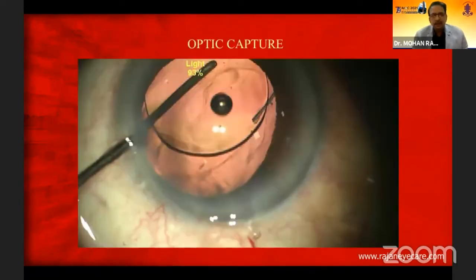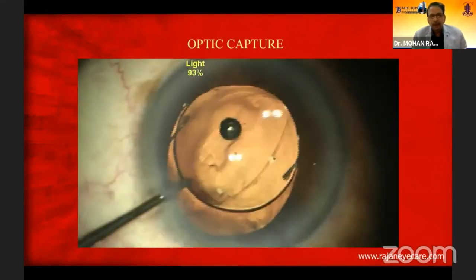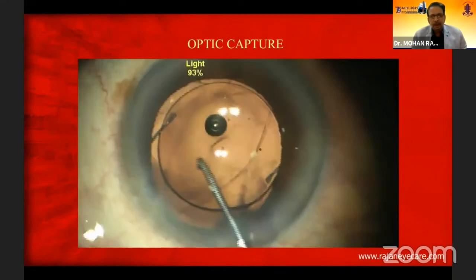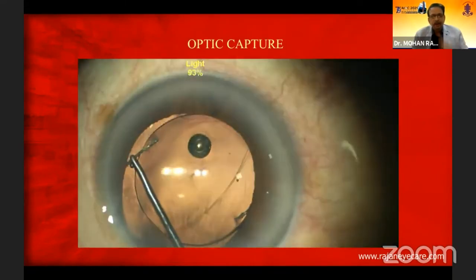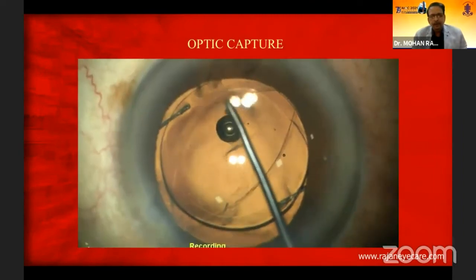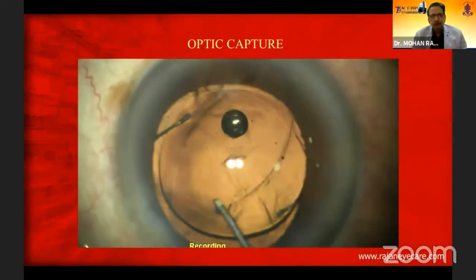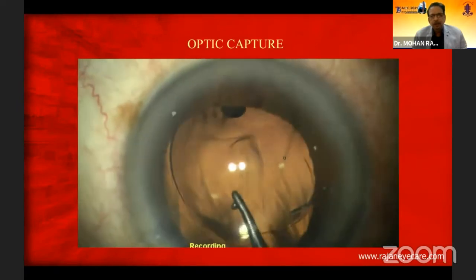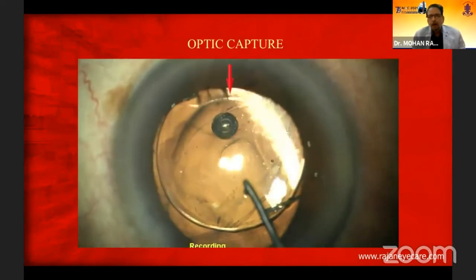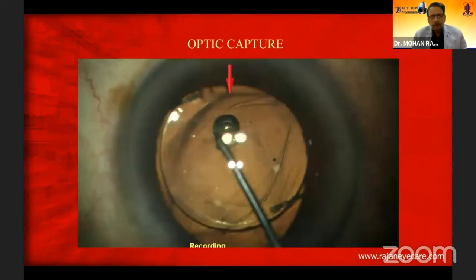Once you have a larger PC tear, I'm trying to do an optic capture. This is a large PC tear in a posterior polar cataract — you can see very typically two pillars on the posterior capsule. The optic capture is done by placing the haptic in the sulcus and the optic is captured into the capsulorrhexis margin.